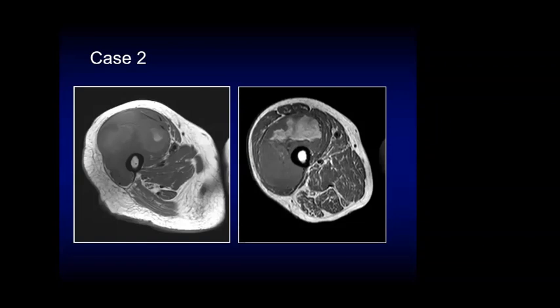May I ask, please, for the exact location of the lesion, if you don't mind, Ustad Harun? So this is in the thigh, proximal thigh.